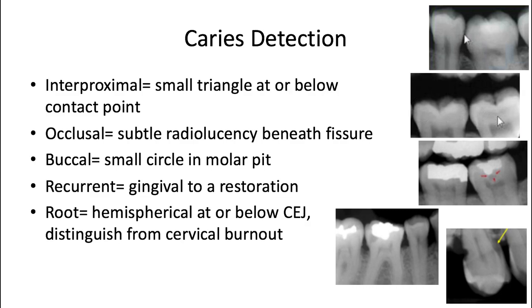For an interproximal lesion, this will typically appear as a tiny triangular radiolucency right at or below the proximal contact — that is the classic interproximal lesion. That one's fairly small, though — it's not into the dentin layer yet, so it can be hard to pick up on.